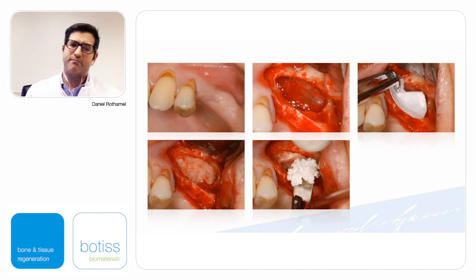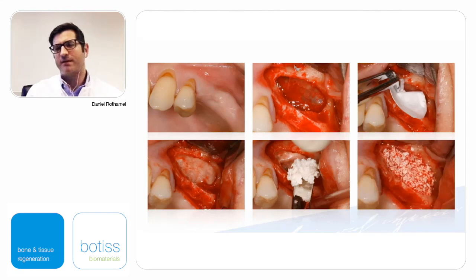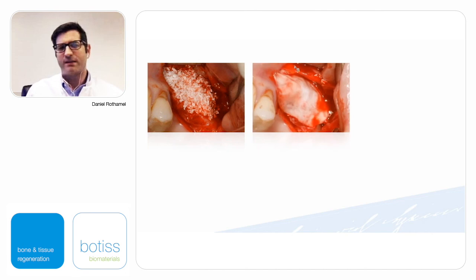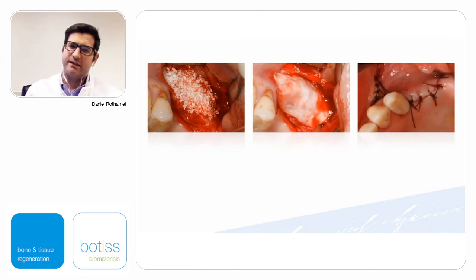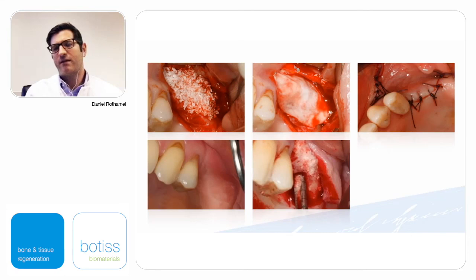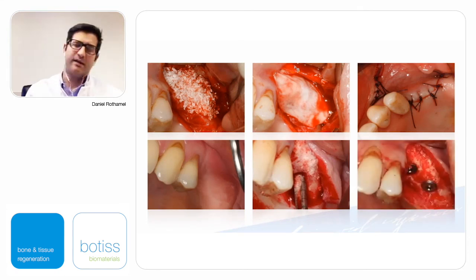Application of this is Maxresorb, a synthetic biphasic beta-TCP hydroxyapatite inside the sinus cavity, and in combination with autogenous bone for the lateral augmentation, same procedure, adjacent membrane on top, healing 6 months, and again a smooth surface. Again, it's a study patient.